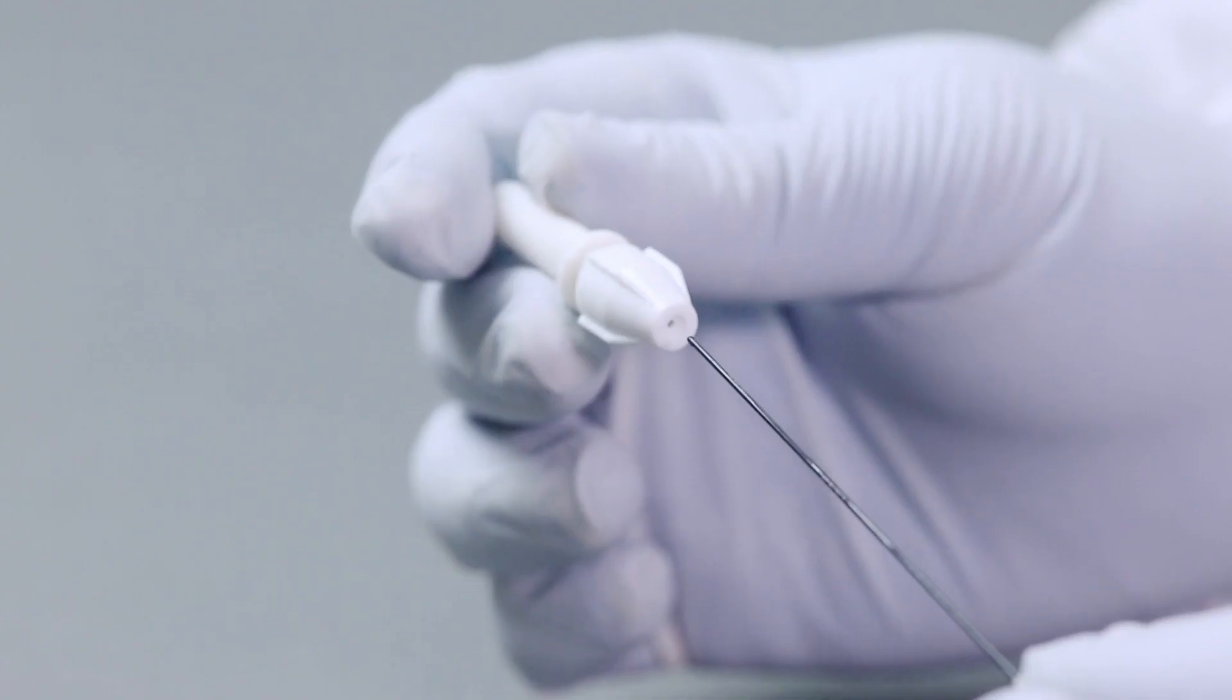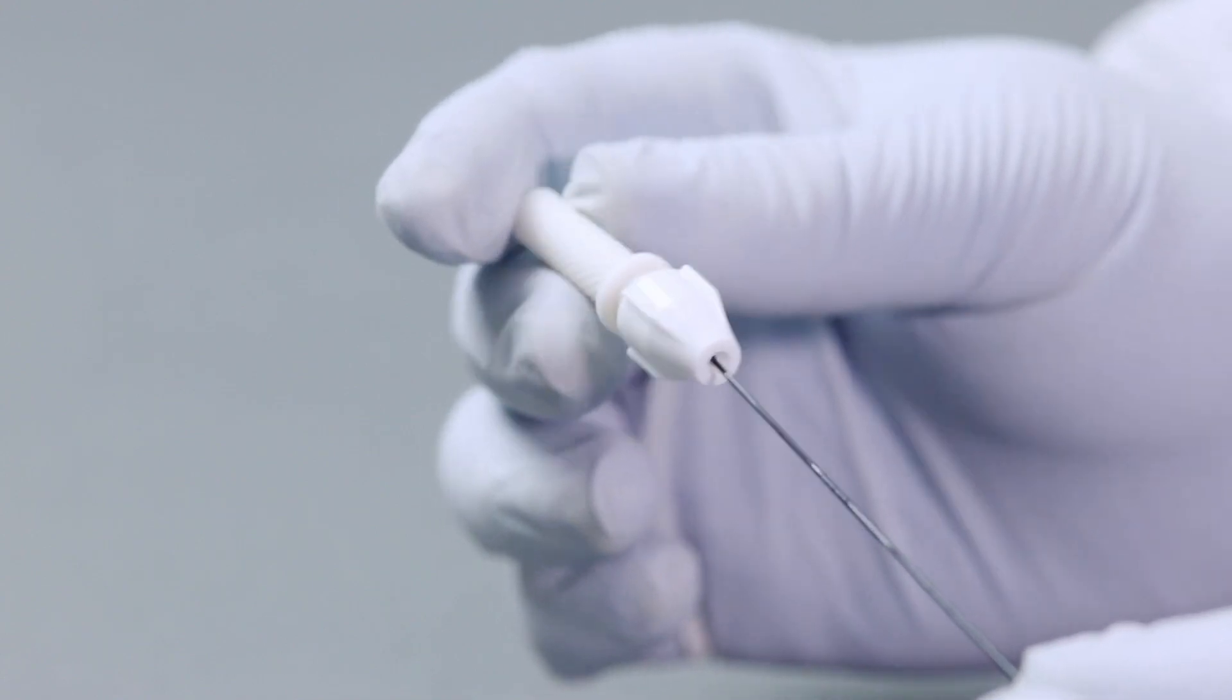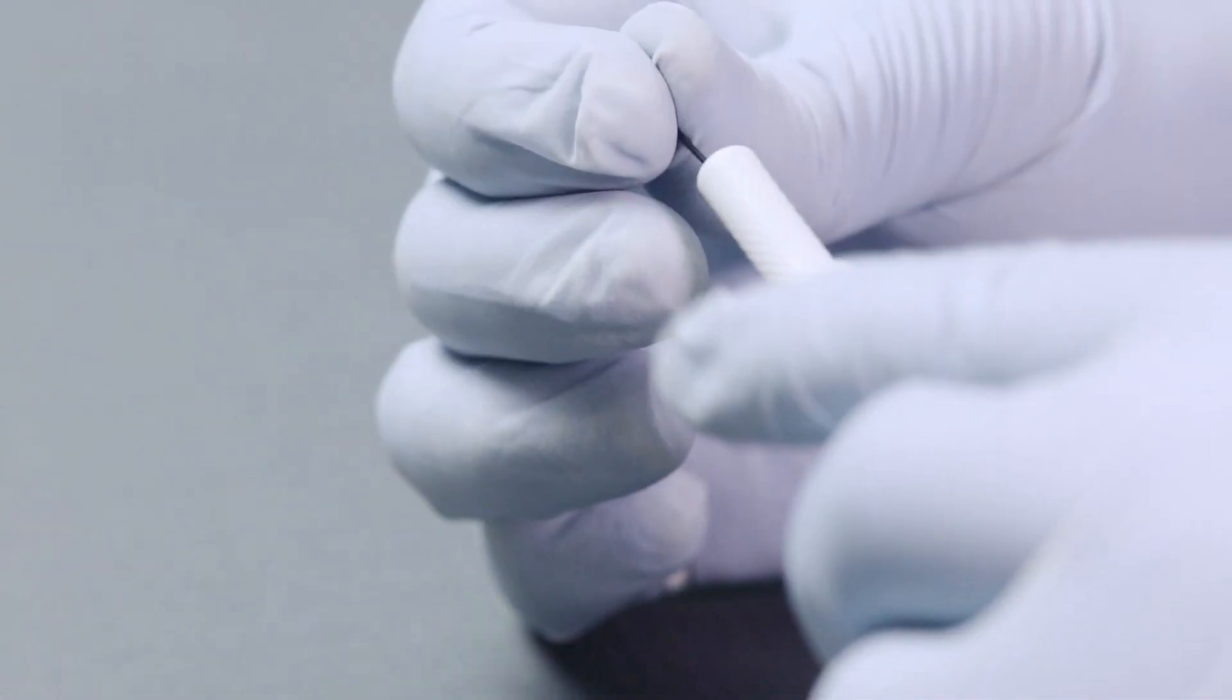If required, a torquer device can be loaded and locked to control the direction of the guide wire tip.